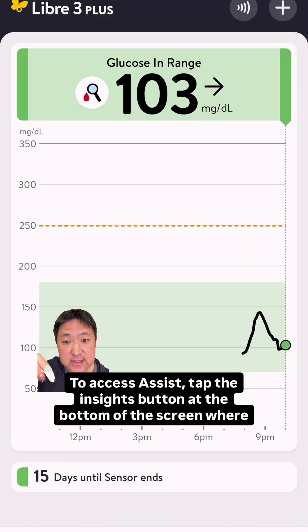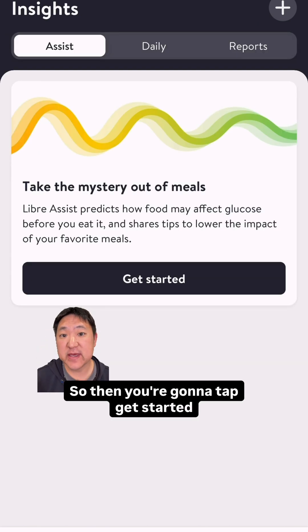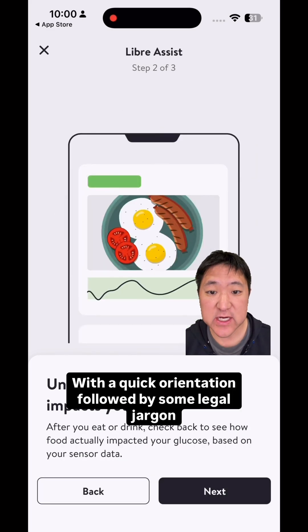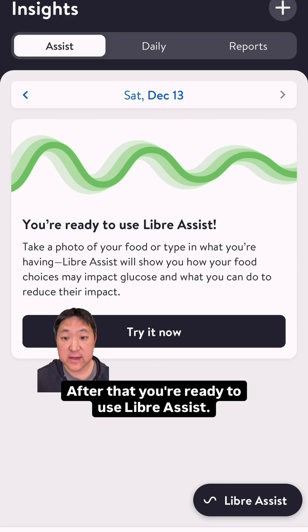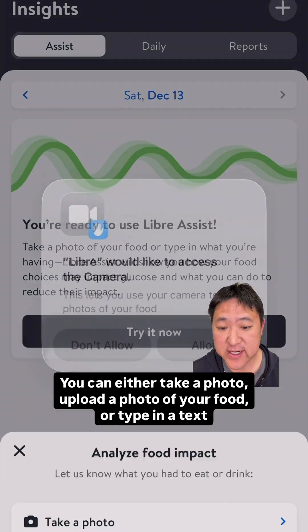To access Assist, tap the Insights button at the bottom of the screen where you'll see a new tab called Assist. Tap Get Started for a quick orientation followed by some legal jargon. After that, you're ready to use Libre Assist. You can tap Try It Now, then either take a photo, upload a photo of your food, or type in a text description of it.